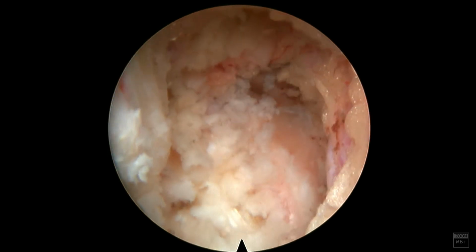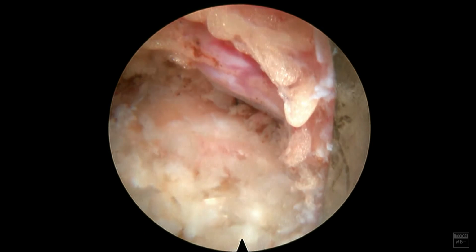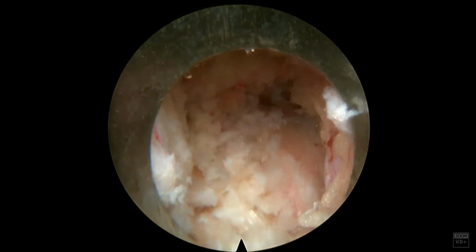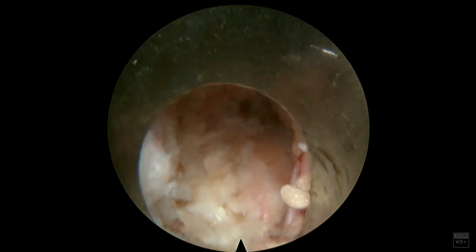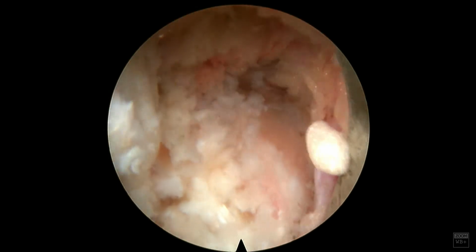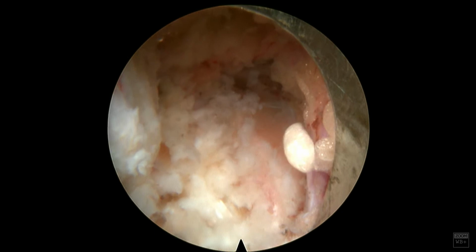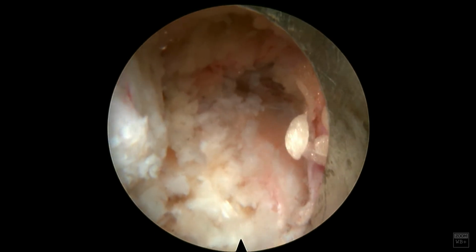Everything's decompressed. The SAP is removed. I removed some of that calcified disc. The L5 nerve looks great. It's free and clear. I know that when this patient gets up, he's not going to have any radicular symptoms. This foraminal area is going to collapse a little bit when the patient stands up. That's where some of that hypertrophic ligamentum flavum and the facet or the SAP can really compress that nerve root. You can imagine that if the full SAP was there as it was initially, you can understand how it can be compressed and cause radicular symptoms.